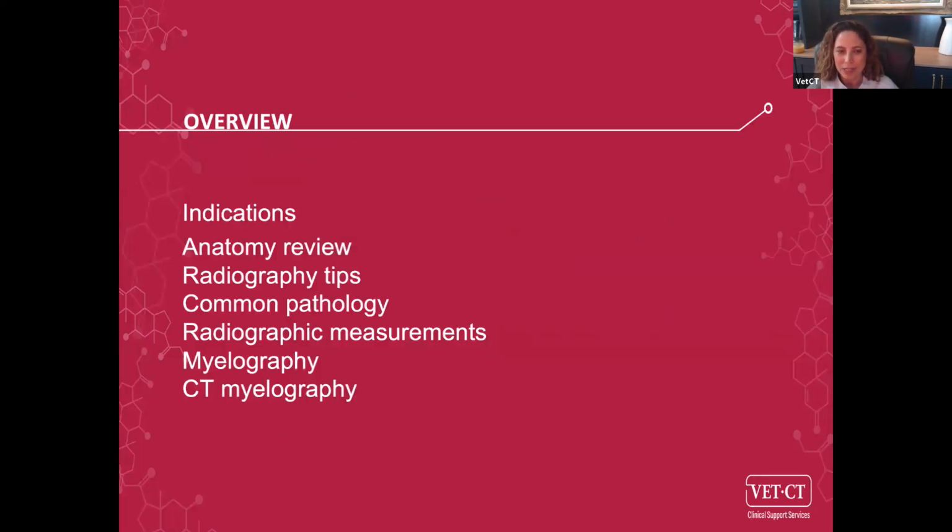Thank you so much for taking time out of your day to listen to me talk. So just a quick overview of what I'm going to cover. We're going to start with indications for cervical spinal radiographs. I'll do an anatomy review, and then I'd really like to cover some radiography tips.